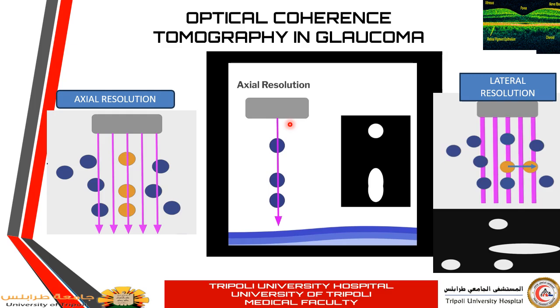So increasing the frequency will lead to shortening the wavelength and give us a high resolution, but this is at the expense of the penetration. When we increase the frequency, the penetration of the rays will be less. So we have to compromise one for the other.